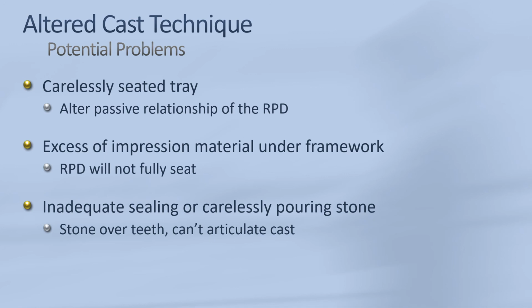When the lab technicians are pouring the new impression, it is quite technique sensitive, and carelessly pouring the stone may cause some problems. The stone could go over the other teeth that are kept on the main cast, for instance. So this is a step that needs to be taken quite seriously.